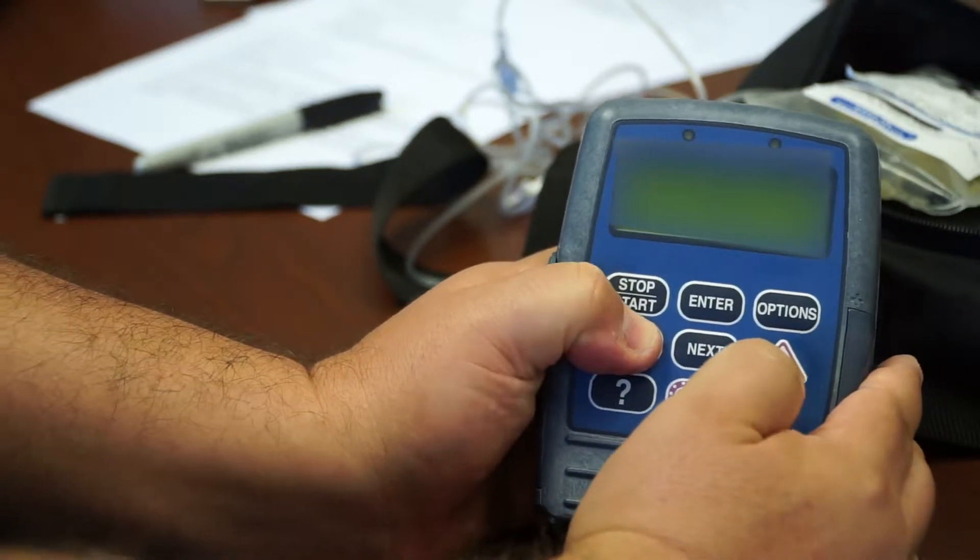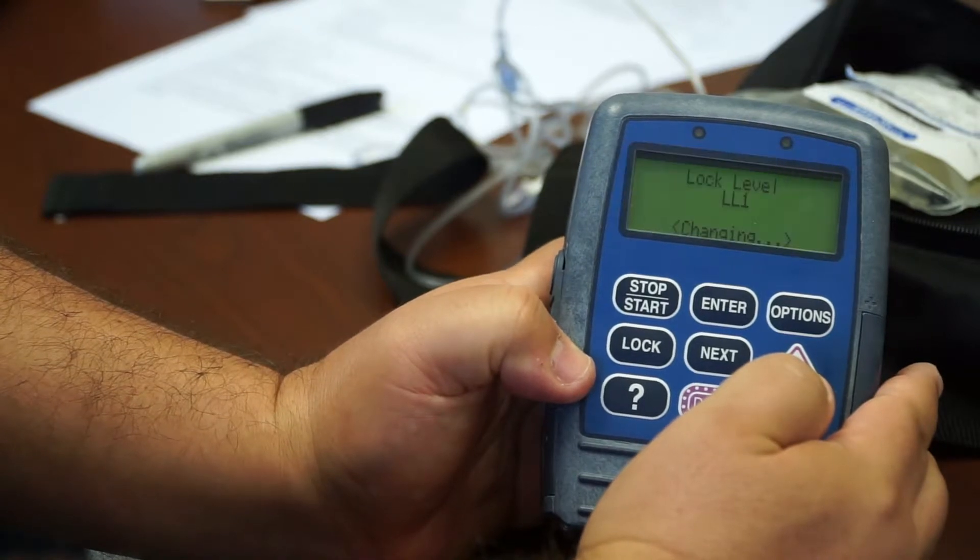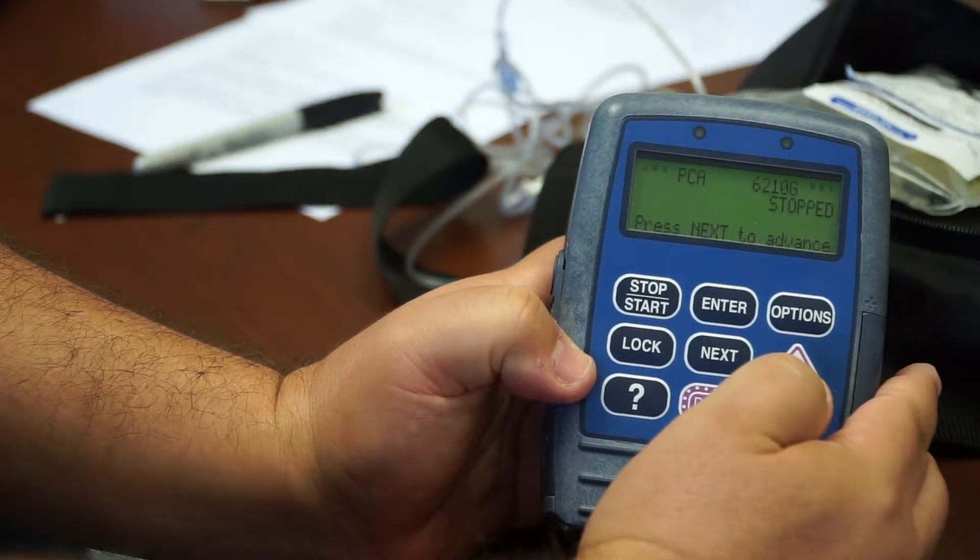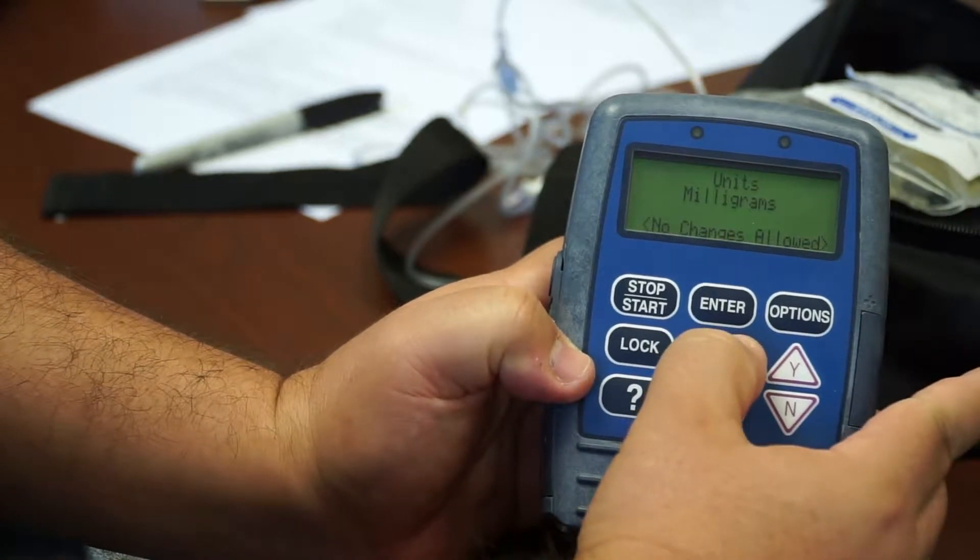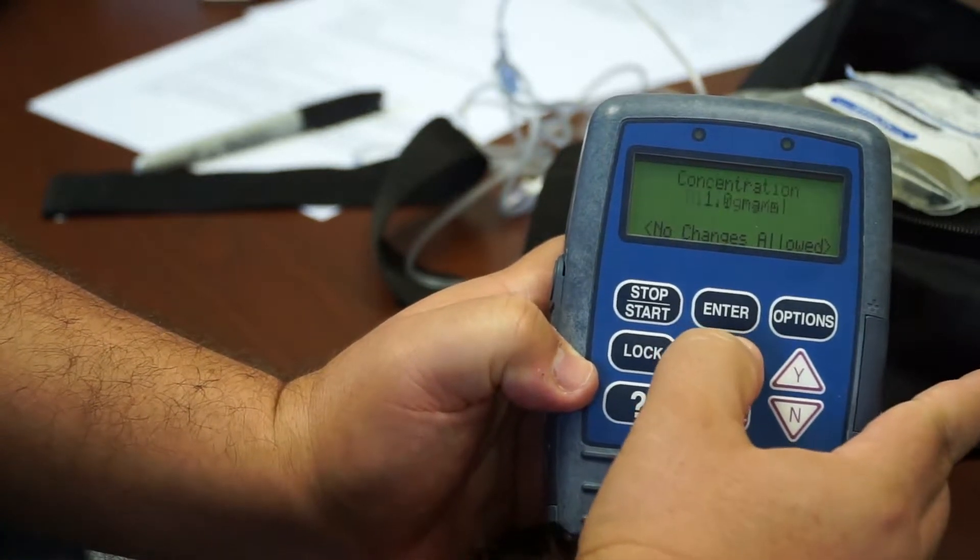You put in the correct code, you click on lock, and it says lock level changing. And now, it's on one. And you can see that the data settings are no longer programmable.